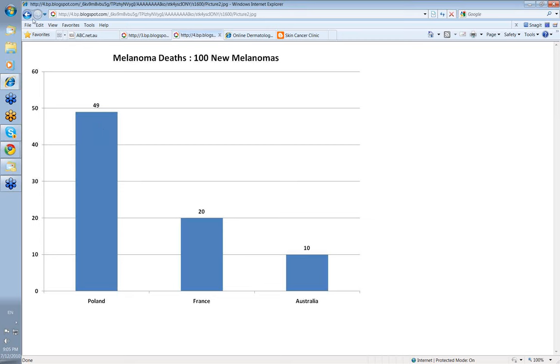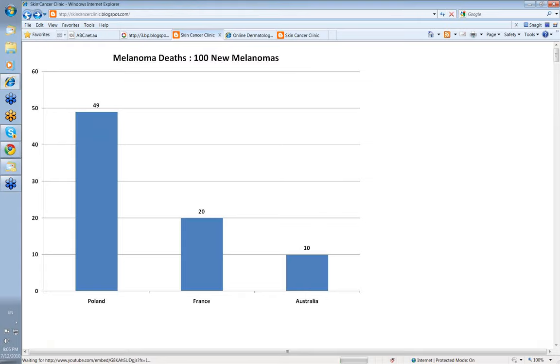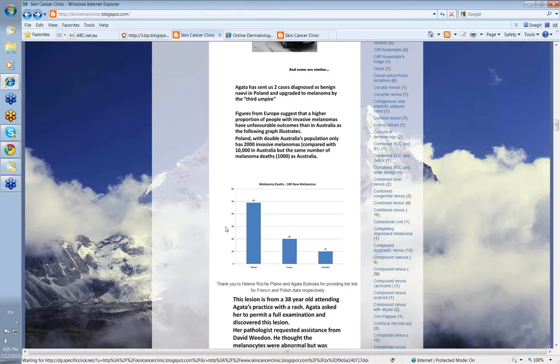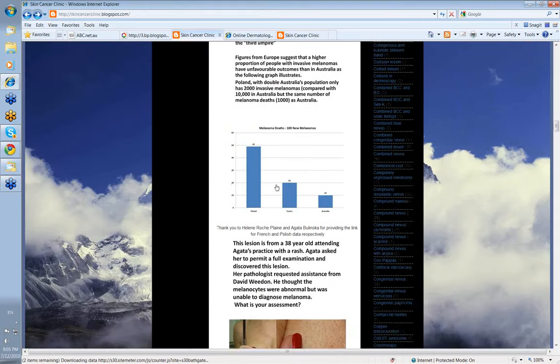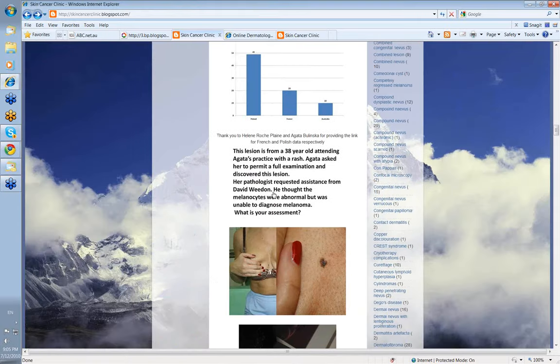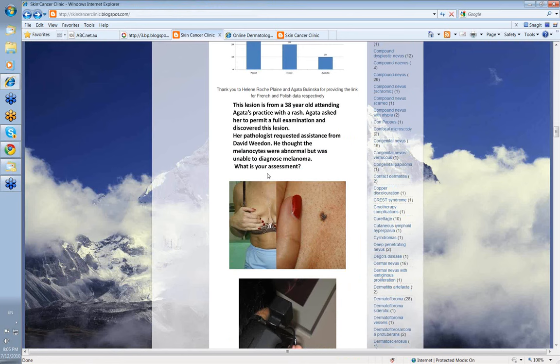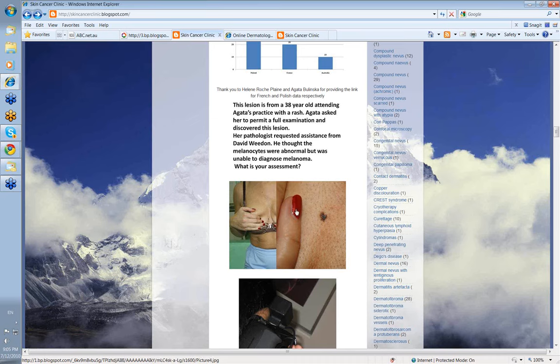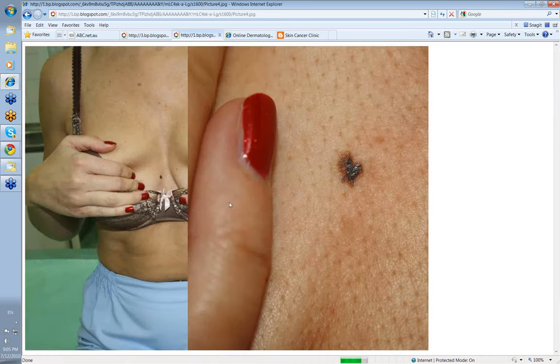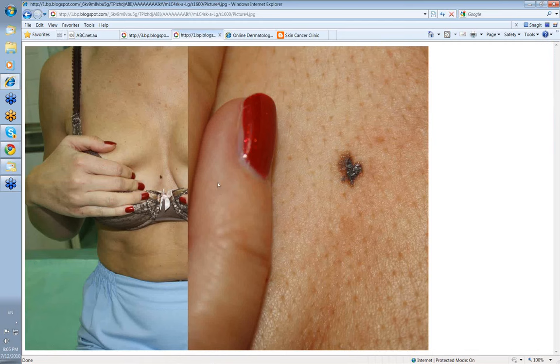All right, well let's look at the case that Cliff has been sent. The lesion was from a 38 year old who was attending his colleague's practice with a rash. A full examination was performed and this was the lesion that the patient presented with.